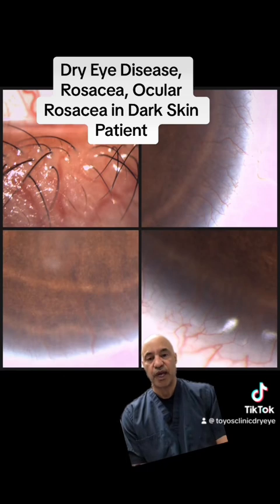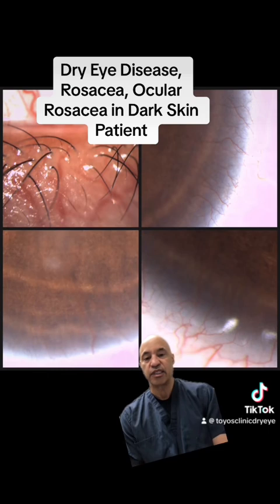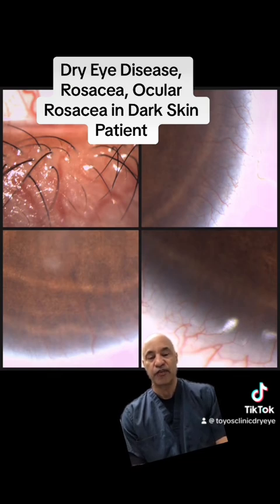Now, if you don't have intense pulse light, or you don't feel comfortable treating these patients, you could do low-level light treatment. Low-level light treatment will not close off these telangiectasias, but it will get some energy to the meibomian glands so that you can actually express these glands and get out that toothpaste-like secretion and get these glands making more of a normal tear. If you can get a normal tear, the inflammation will decrease, and these abnormal blood vessels on the cornea that are causing destruction will slowly go away.